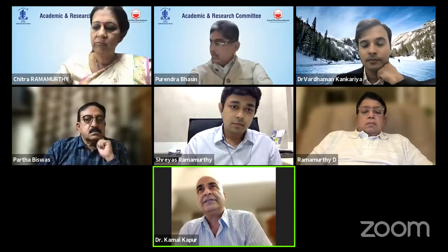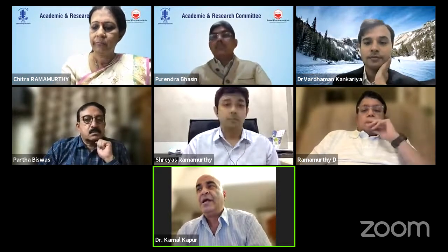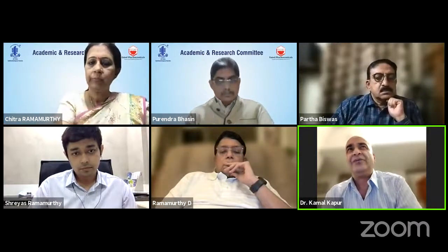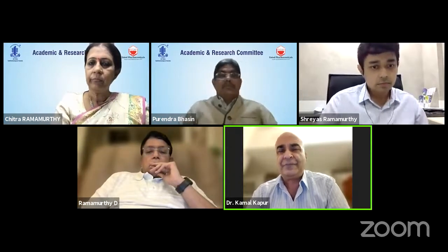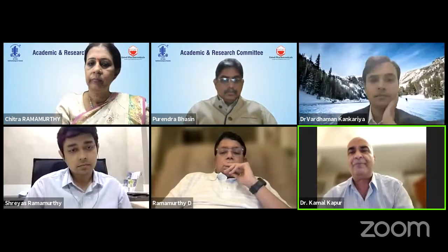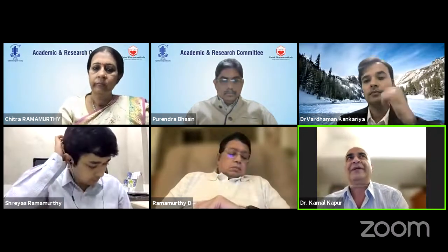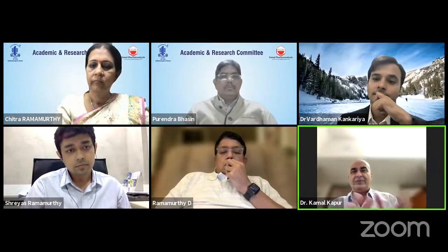Okay, I think this is a very, very useful question for most of the beginner young ophthalmologists. I think the role of topography comes more so when we are looking at corneal suspects, where we are looking at corneal pathologies. And a lot of times, with a little bit of experience, you are able to look at some potential corneal abnormalities. Most of these patients who come to us for refractive corrections, more so for the case of medico-legal, because when we are doing a refractive procedure on the cornea, that is the time corneal topography for a beginner practitioner comes in more handy.